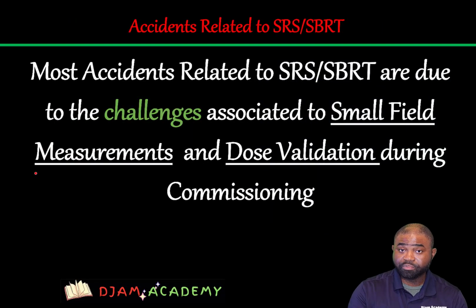Thank you. I appreciate you staying tuned for this presentation. The next part of this presentation, we will look at some aspects of small field dosimetry.